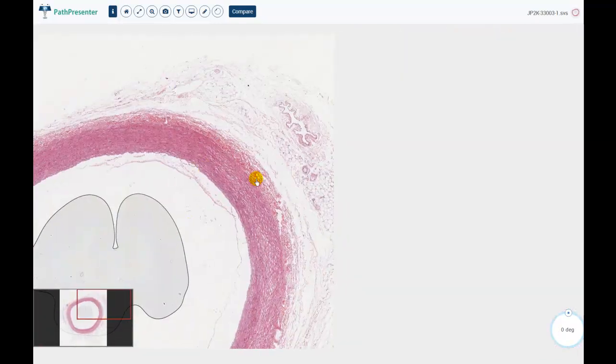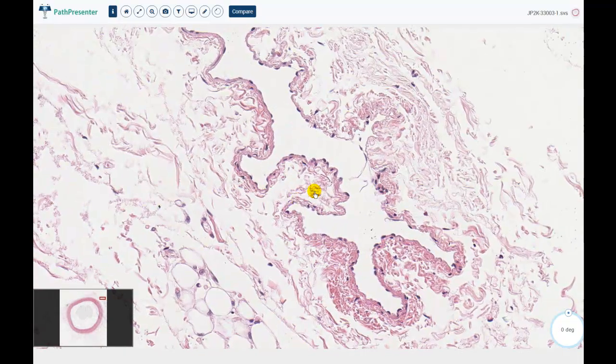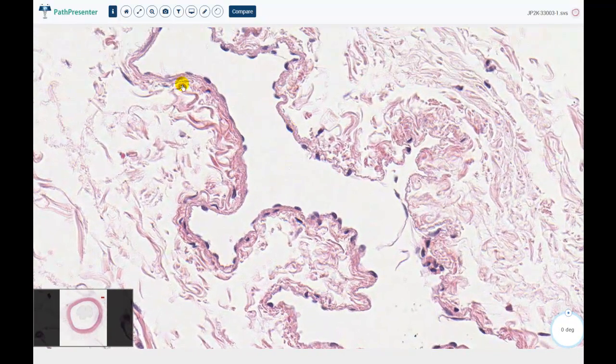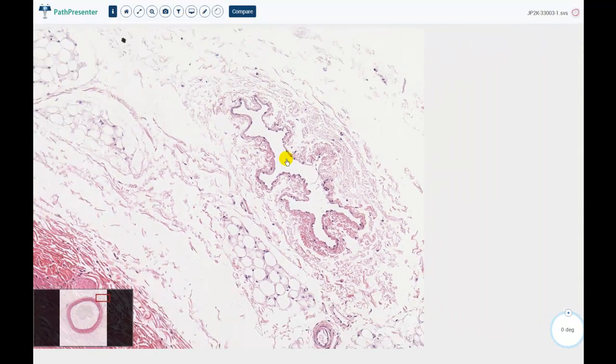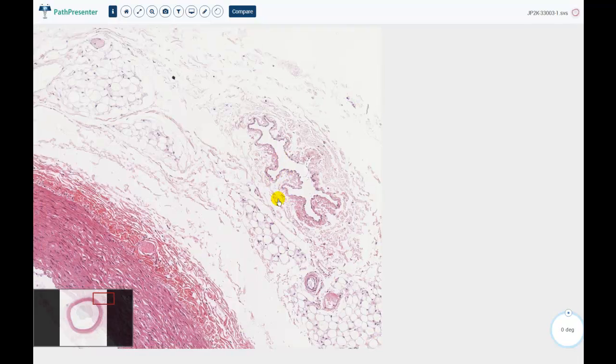Also, over here is another lymphatic vessel. You see, it has some collagen that is just underneath what we might call the lymphatic endothelium. You see these dark nuclei here. Those are the endothelial cells on this lymphatic. So lymphatics are very, very low pressure and irregular, and in life this would be perhaps rounded out.